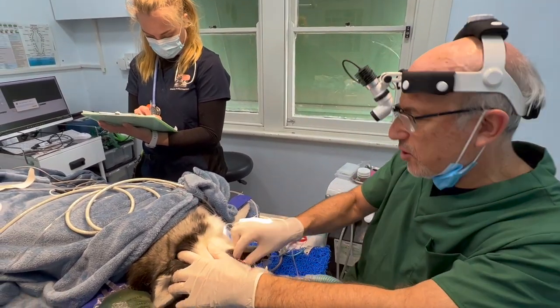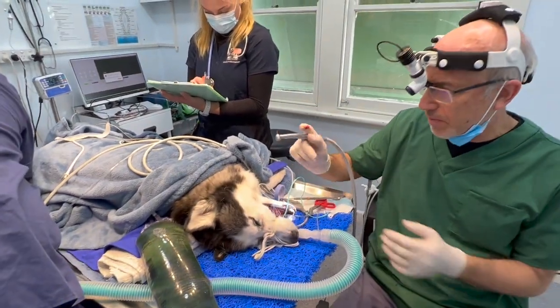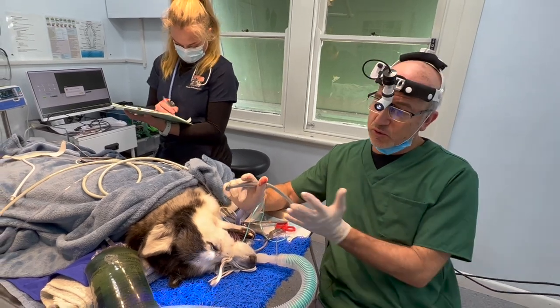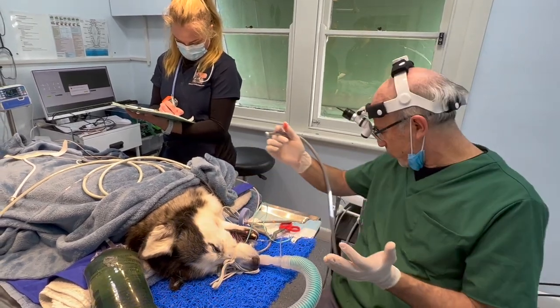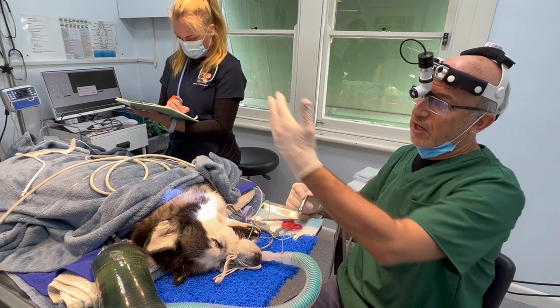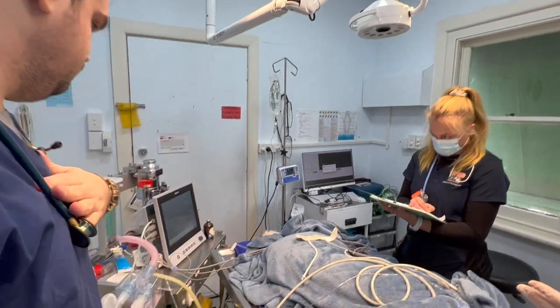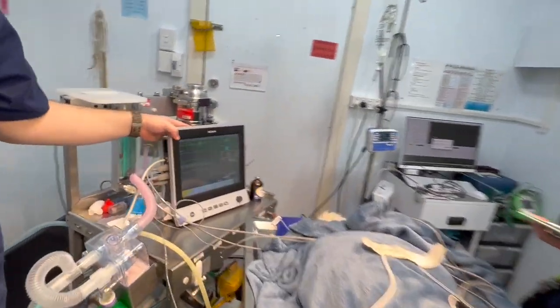It's really nice to have good dental equipment — this is a fast handpiece. He's got little swabs in the back of his throat so he can't swallow any of the water that comes out here, because we want to spray this water. You can see there's monitoring; we've got an anesthetist and an assistant anesthetist. You can hear the ECG beeping like in an ICU.